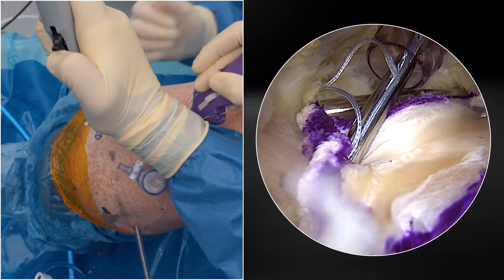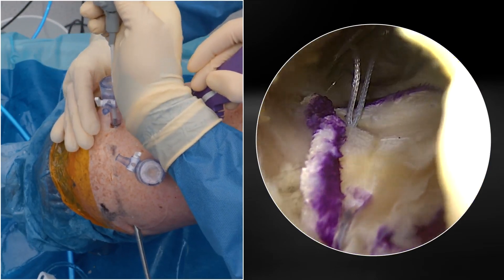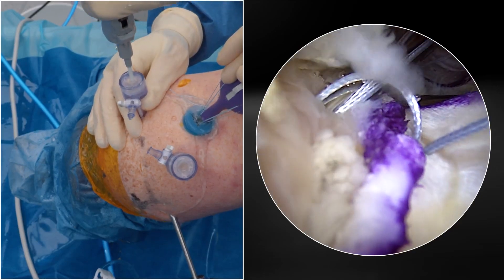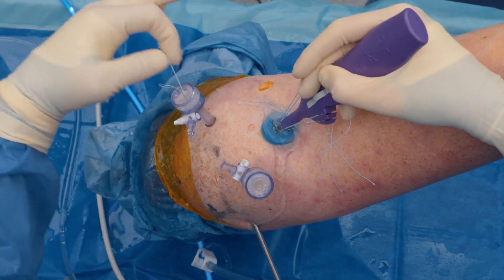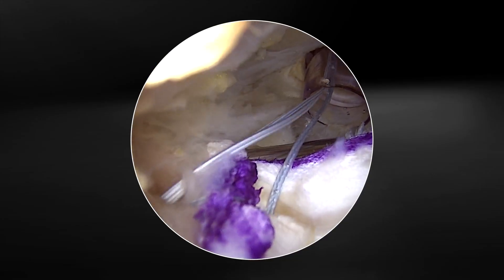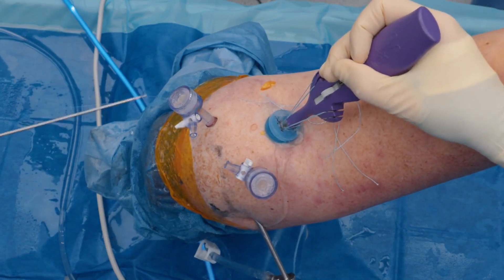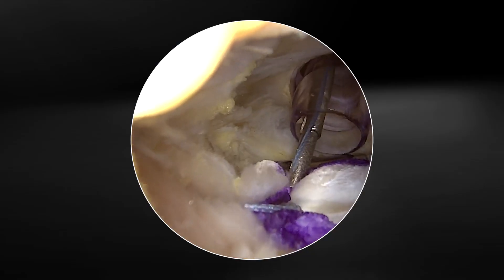I then simply go forward and my second arm is ready to be deployed. I back this out and come over the top of the front side. That drops in and I send my fiber stitch wheel back again, which deploys the second pledget, and then all we have to do is remove the fiber stitch. This gives us a loop and a double mattress. I pull the second limb of our mattress stitch down and it will allow us to compress. This gives us an excellent first anchor stitch medially on the patch. We then bring the tensioner cutter for a flush cut down against the patch.